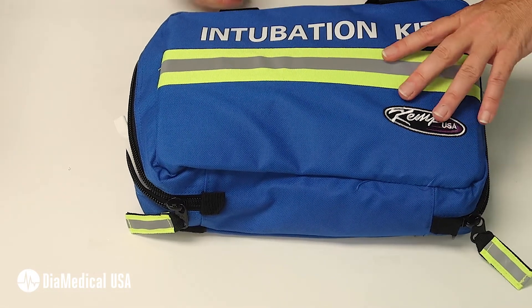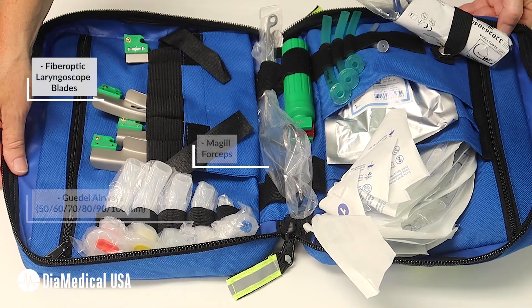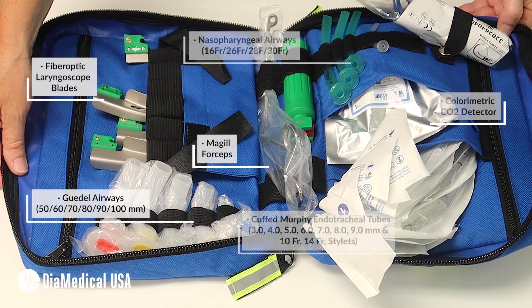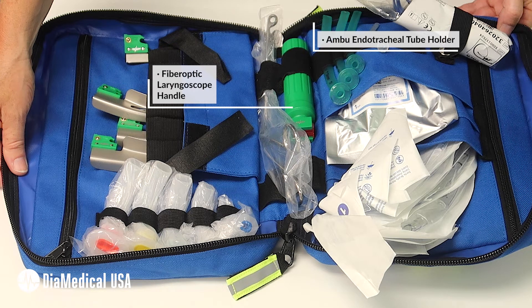The intubation kit is clearly visible in the blue pouch. The fiber optic laryngoscope blades provide bright white light for a clear view during intubation, and the colorimetric CO2 indicator quickly verifies endotracheal tube placement.